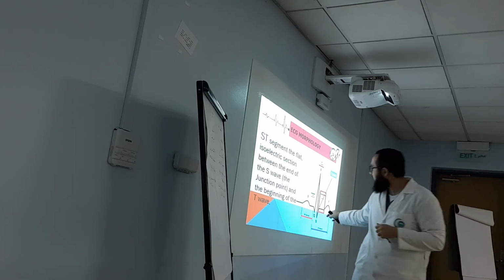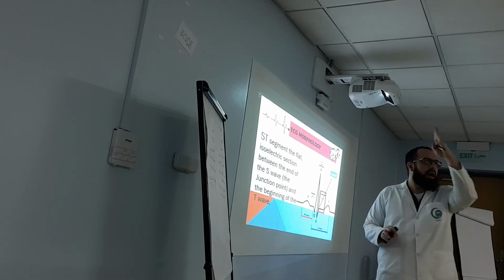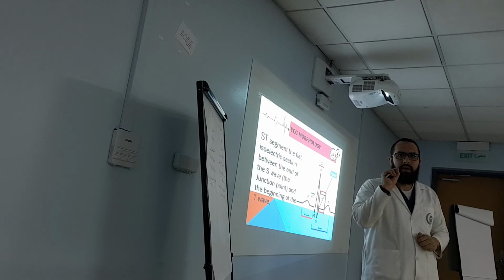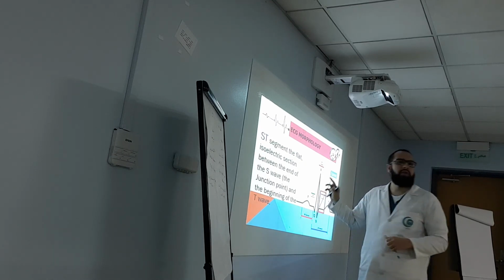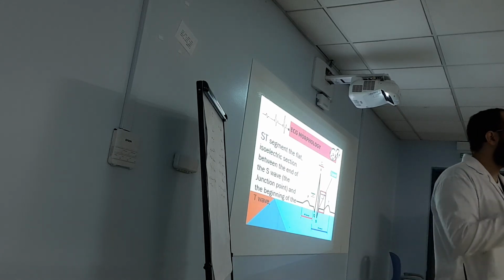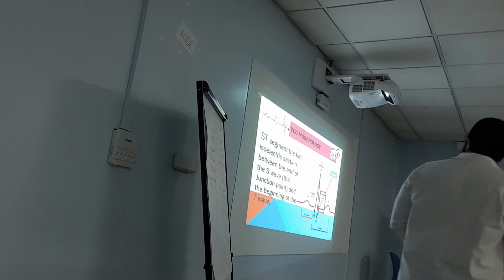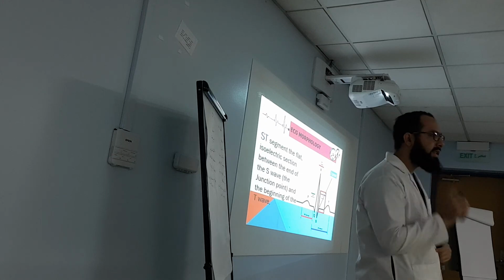So when should I say there is ST segment elevation? You see the line is going up. Once it starts to have an angle, a divergence, this is the J point. From there, how high this point is from the isoelectric line is your ST segment elevation. Because the ST segment is not flat, maybe it is oblique, maybe curved, maybe skewed, you need to identify this point, and this is the point of elevation for the ST segment.